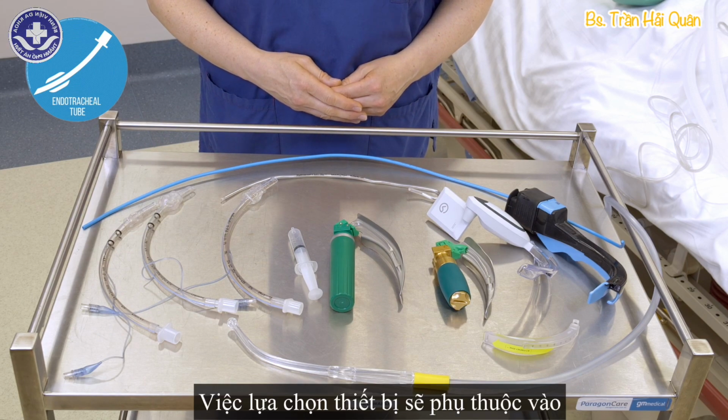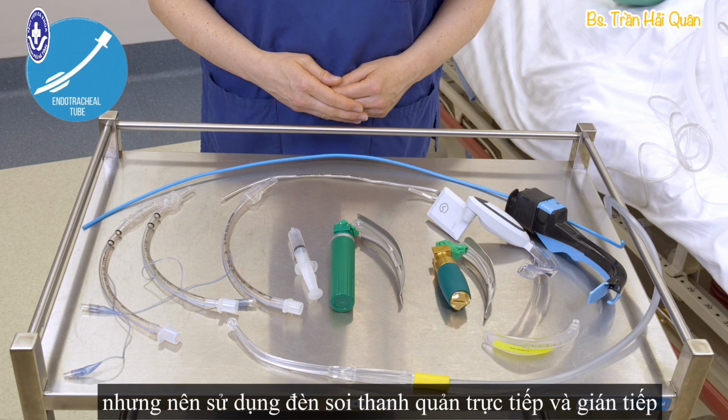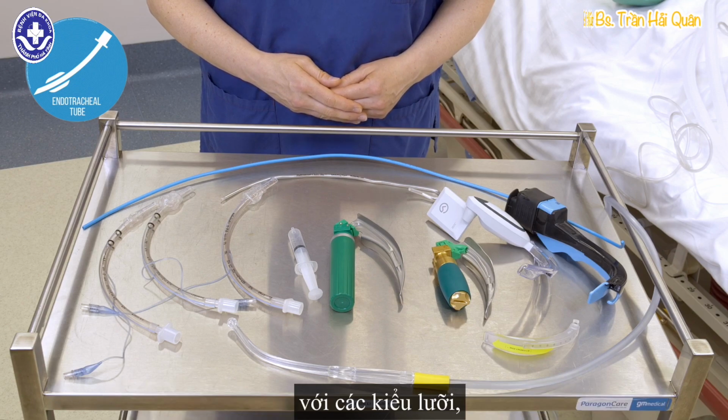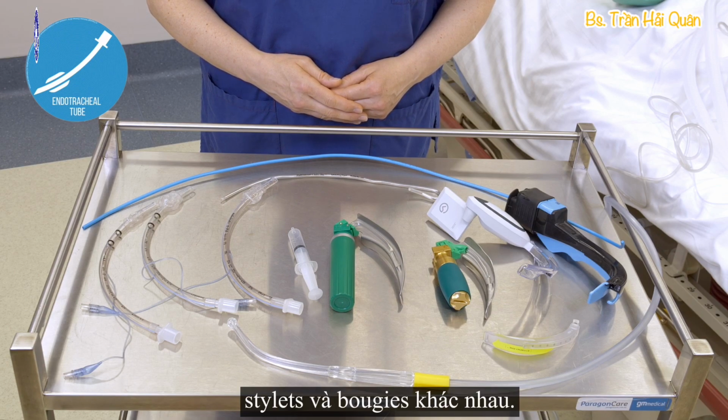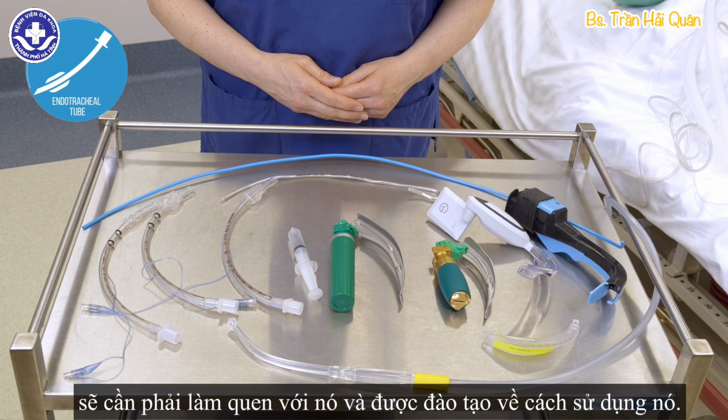The choice of equipment will depend on local availability, but direct and indirect laryngoscopes with different styles of blades, stylets and bougies are desirable. Staff using the equipment will need to be familiar with it and trained in its use.